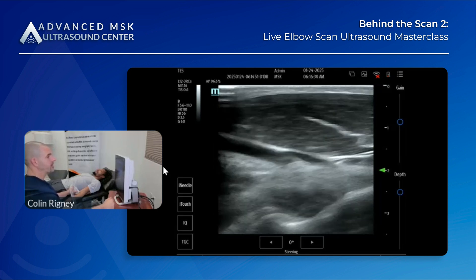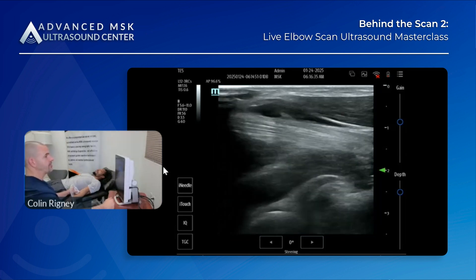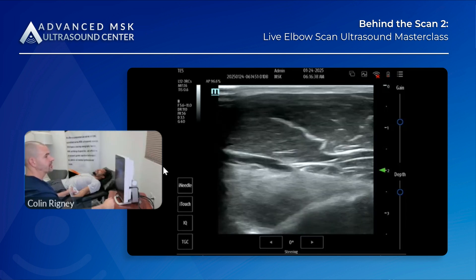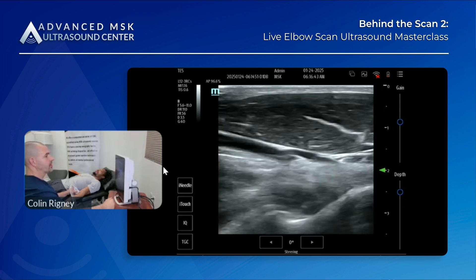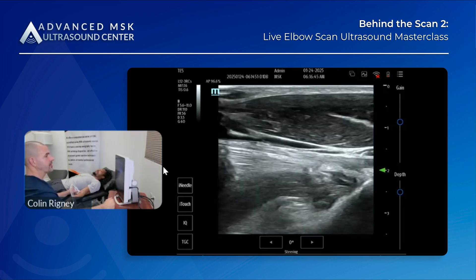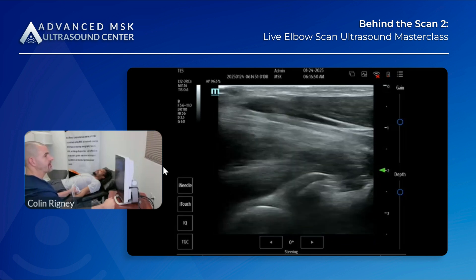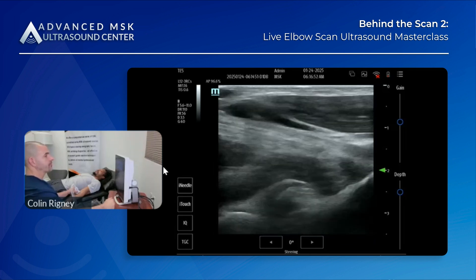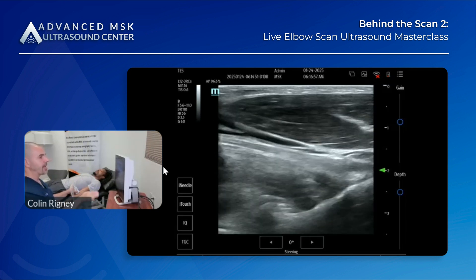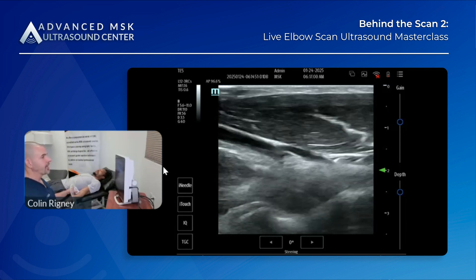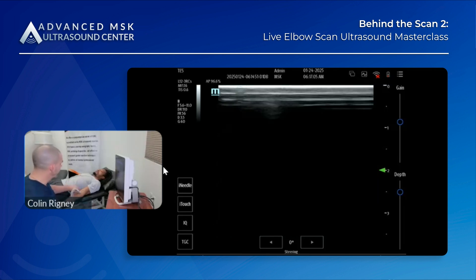You can track this proximally and you see the steep dive it takes from the antecubital fossa to the radial tuberosity. When you're hunting for a tear and retraction, it's variable — the lacertus may be tacking it down so it's not fully retracted, or sometimes it snaps up to the cubital fossa like a rubber band. That's for you to go find. That's our anterior window.